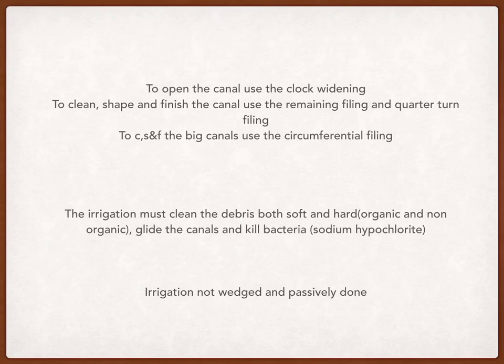The irrigation, as I have said, is one of the most important things that should clean the debris, both soft and hard, and the organic and non-organic hard debris.